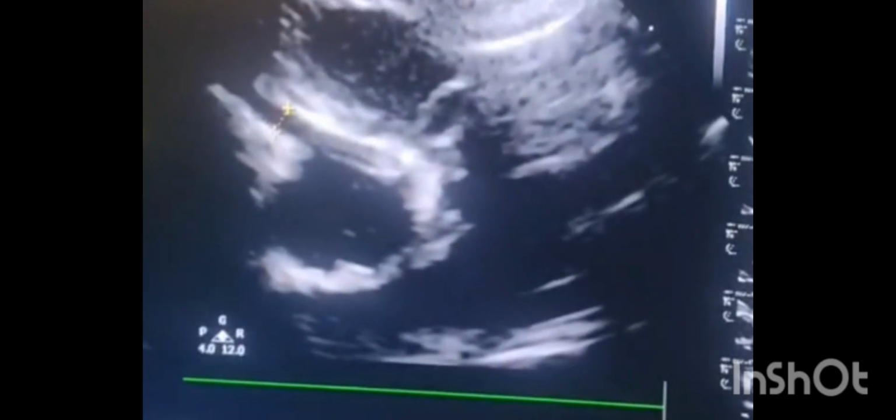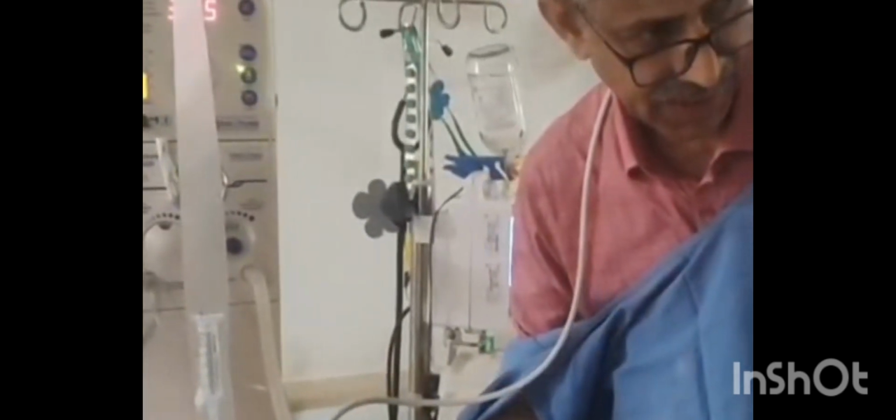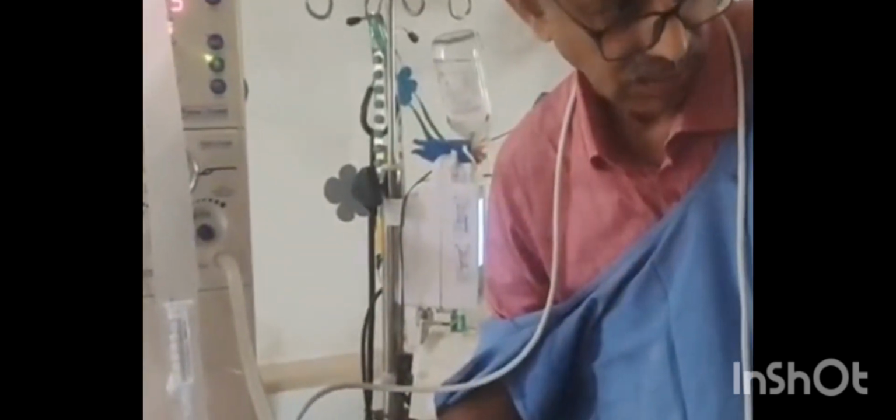So are you okay? Now, the next important thing you should look at is the demonstration of the left coronary artery. Now I'll freeze it.